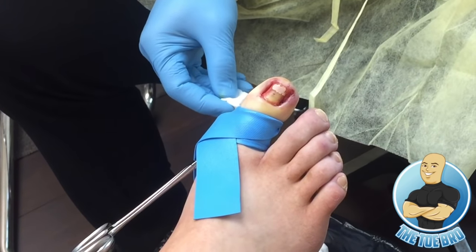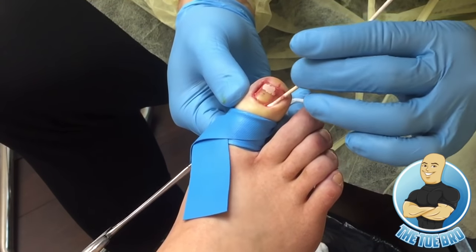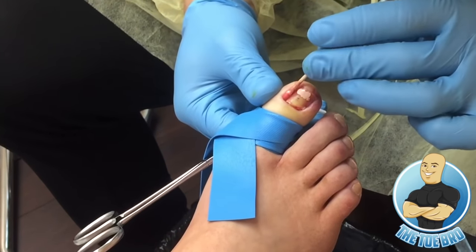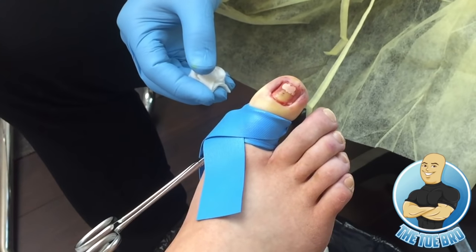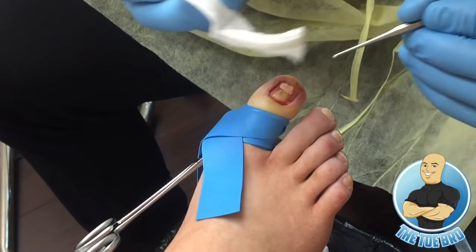So I'm using a cotton tip applicator to dry out the area so there's very little to no blood. As you can see, the wound isn't bleeding at all. And after this, I'm gonna use a little tool, a curette or a Black's file, to check the side of the nail to make sure the cut goes straight all the way down, that there's no nail spike left behind or no piece of the nail left behind.